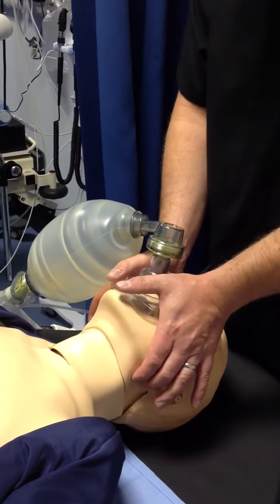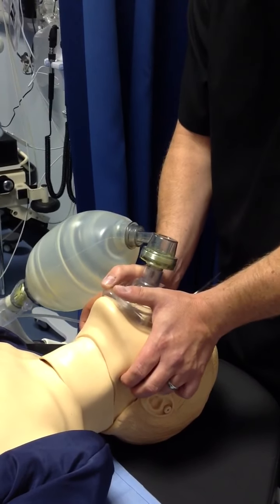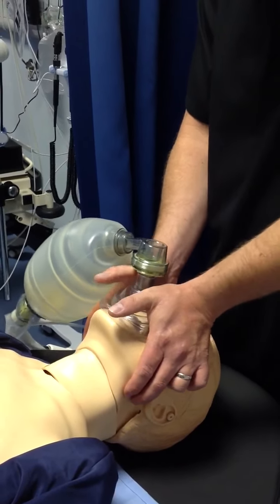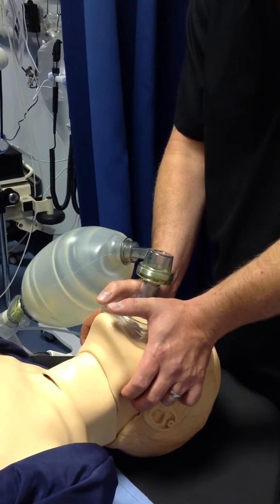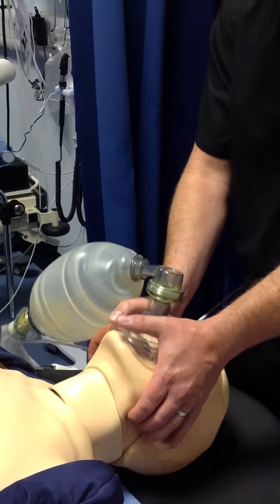What you're effectively doing is using these two fingers to pull the jaw upwards. It helps tilt the head back, and you're using the heels of your hands to push the mask down to create a seal on the mask. Use both hands to maintain this airway.